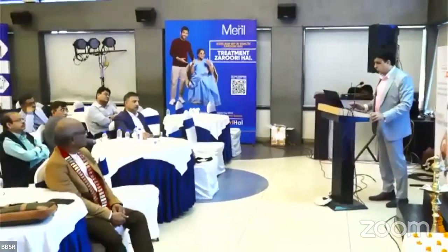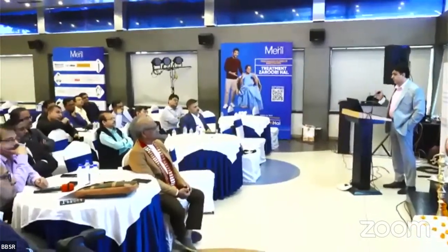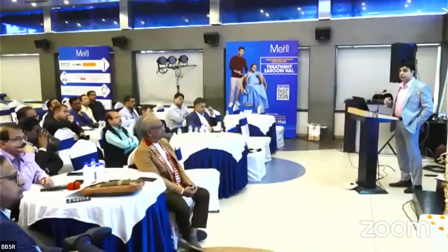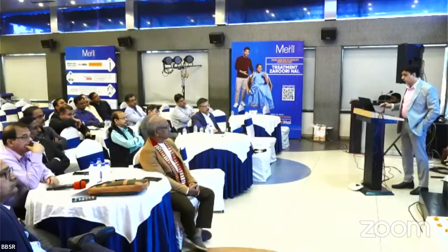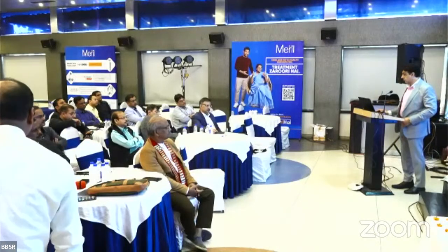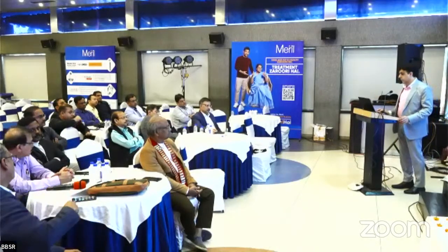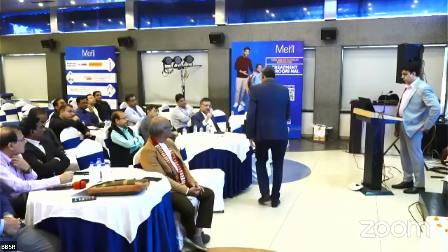Is the fact that you need to cover these; these are the options that you have to keep in mind. So leave it as such, or attempt a re-arthrodesis in this case. You can do a single-stage revision or you can move back in two stages. First, get off, do a debridement again, put up a spacer and then come back into it. These are the options that have to be in your mind. I was going to work with both C and D in mind. I'll move inside and see, but if everything is stable, I'll go back and revise in a single go. The challenges are, number one, the exposure.